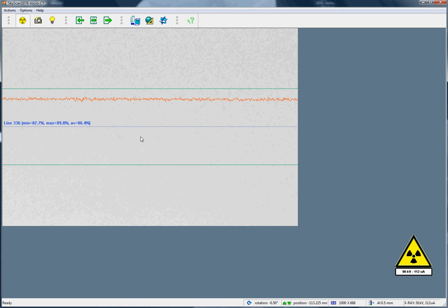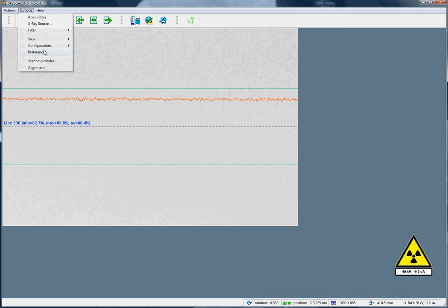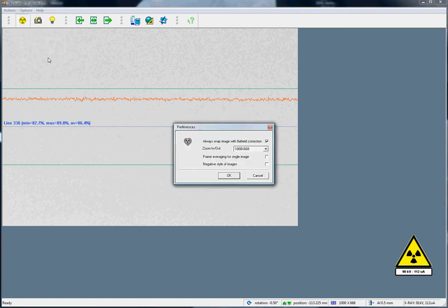If we want to see the image without the correction, we go to options, preferences, and we deselect the first option, snap image with flat field correction.